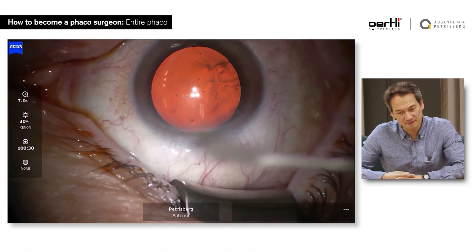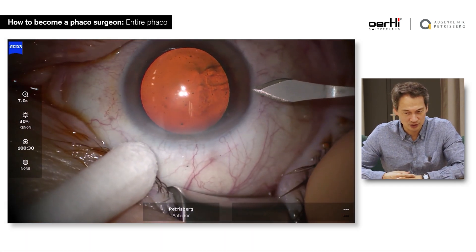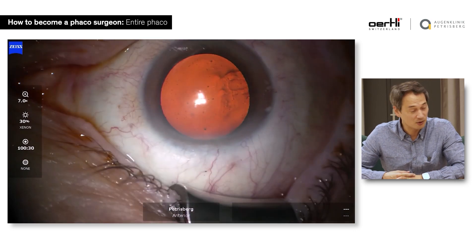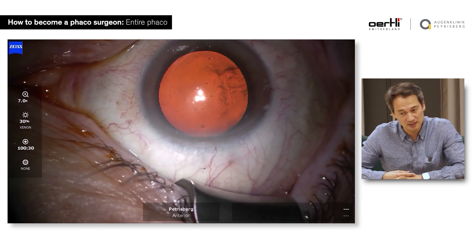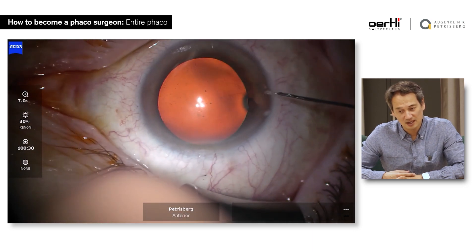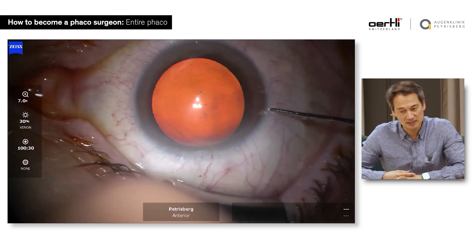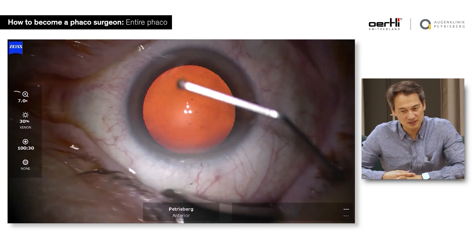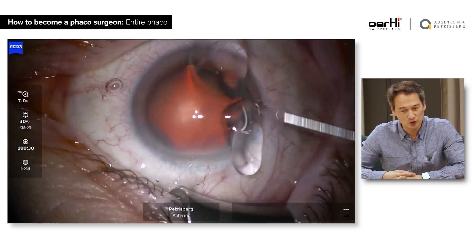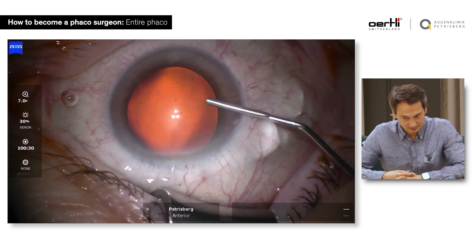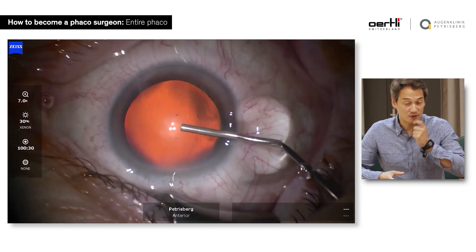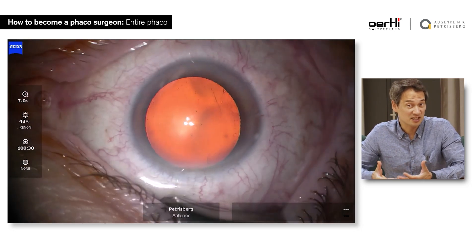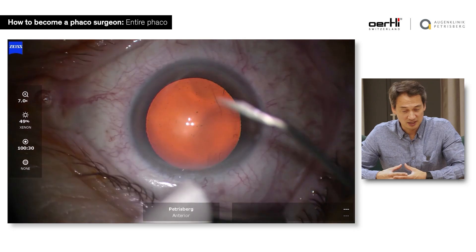You will probably have managed a lot of complications — now look at them. This is a tunnel; this is not a very clear cornea tunnel, this is quite the limbal tunnel that we have in there. I do local anesthetic injected into the eye, then I put OVD into the anterior chamber and on top of the cornea first, just to get the air bubbles out, because you don't want air bubbles inside the anterior chamber.